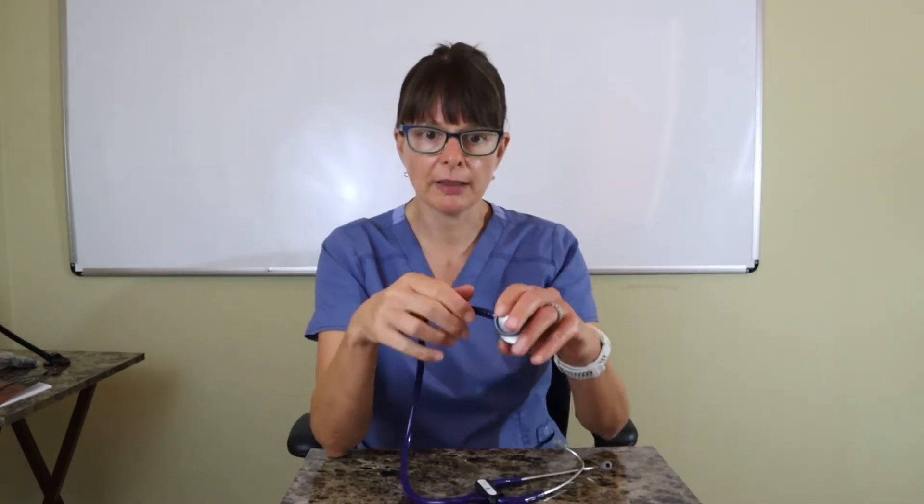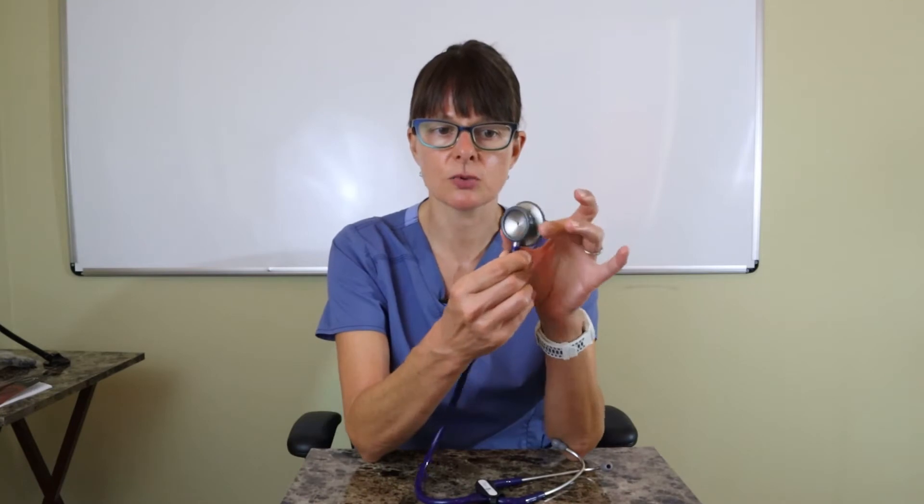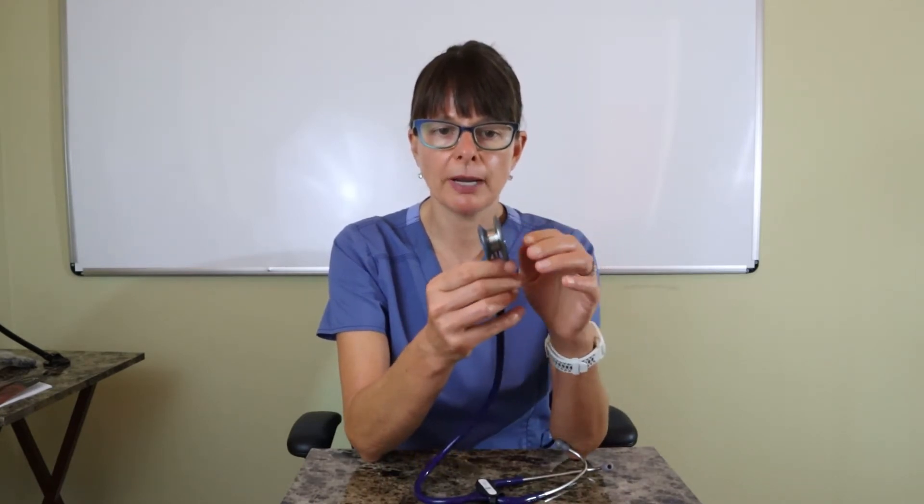It has a single flexible tube which is really good quality. As for the bell and diaphragm, it is reversible — to use the bell you flip it around and you can see this little opening rather than it being closed. The bell is used for more low-pitched sounds such as heart murmurs and vascular sounds, while the larger diaphragm is used for breath sounds and bowel sounds, which are typically more high-pitched.